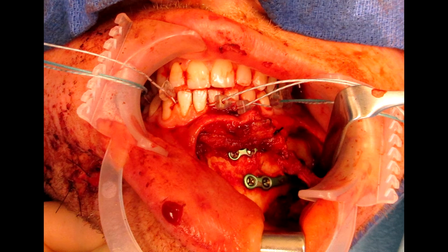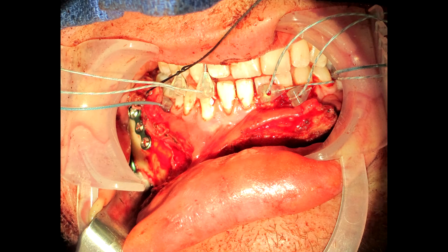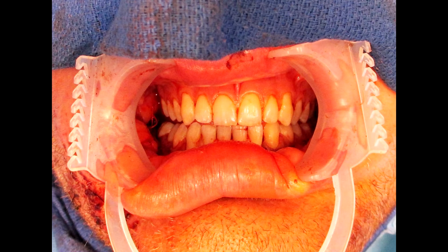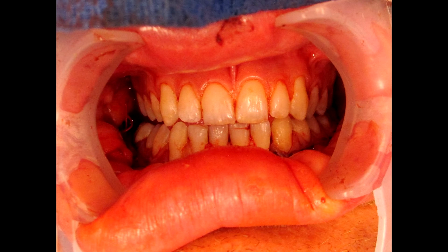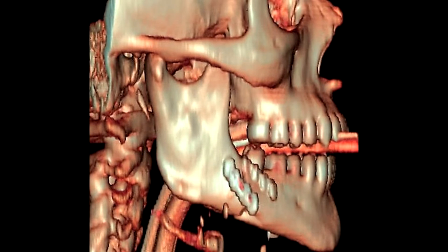The parasymphyseal fracture was plated with standard technique using titanium plates. The mandibular angle fracture was also plated with standard technique. The incisions were closed and the devices were removed. The patient was allowed to open and close his jaw postoperatively. The patient reported normal occlusion and has made a full recovery. The postoperative CT scan shows good reduction of the fractures and return of premorbid occlusion.